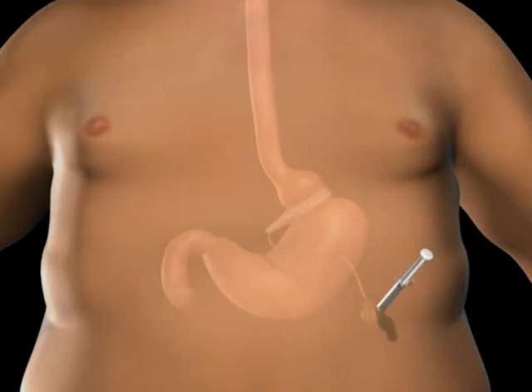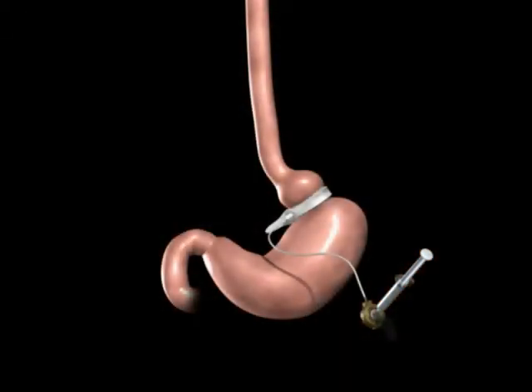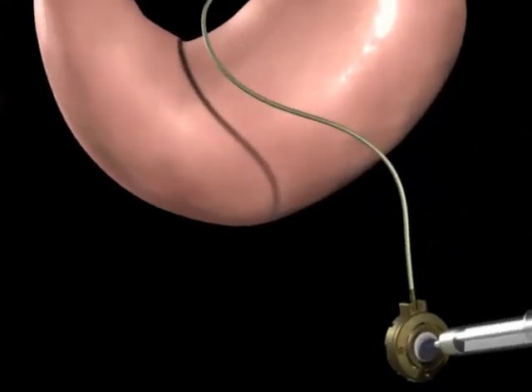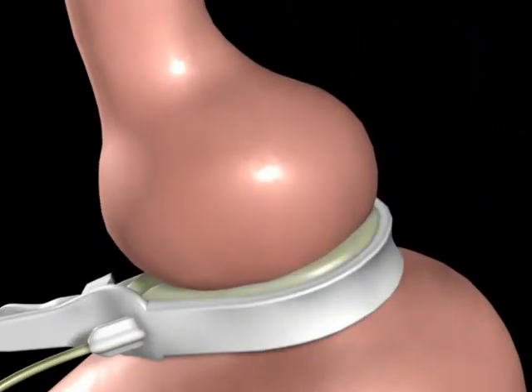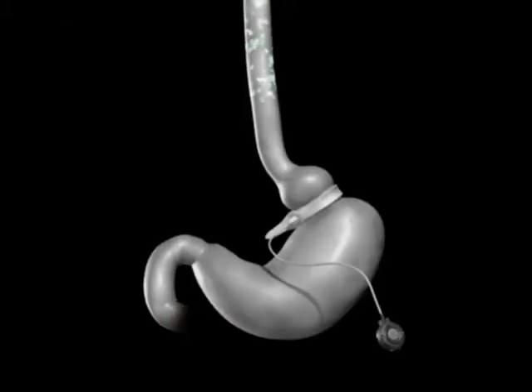Your surgeon may tighten the Realize band by injecting saline into the injection port. As the saline is introduced to the Realize injection port, it travels through the tube to the band. The addition of saline to the band creates a smaller upper stomach pouch, which restricts the amount of food you can eat before feeling full.